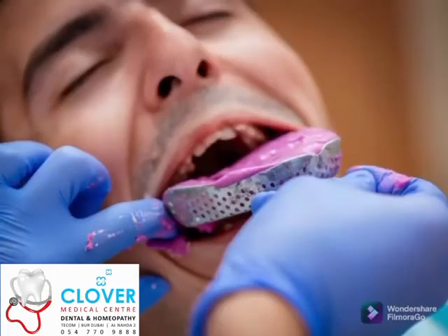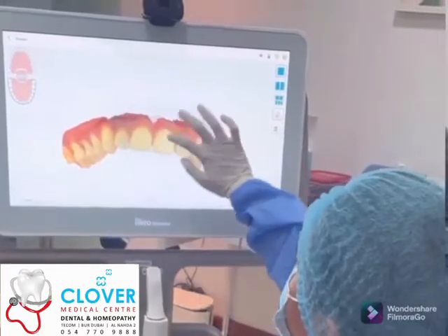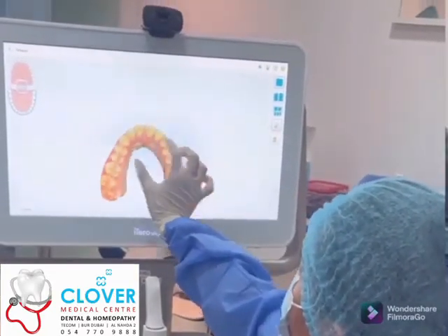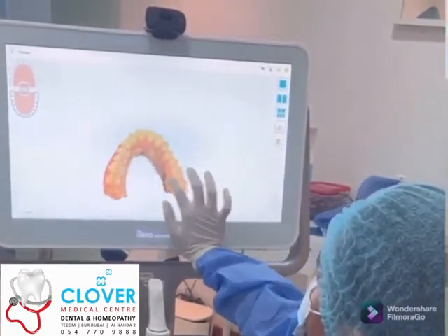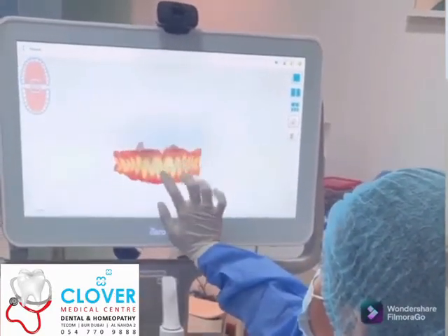Now, what are the uses of this intraoral scanner? How is it advantageous to us? So it allows us to give you a more positive and more comfortable experience, as there is no use of the traditional impression technique, which is quite cumbersome and uncomfortable. And also, as you are able to see on the screen the inside of your mouth, you are able to be confident in the diagnosis and the treatment plan that we are making.